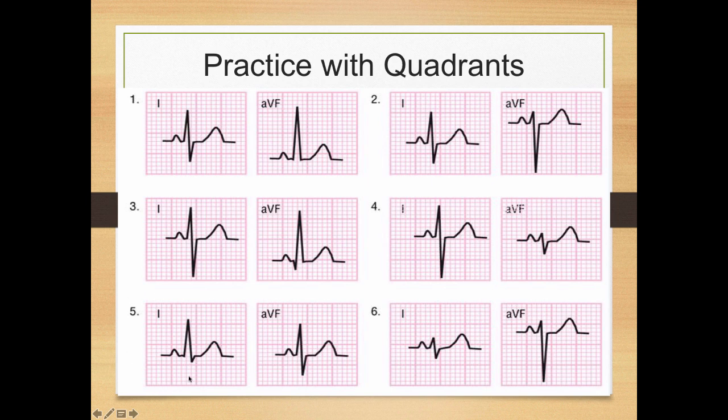Example number 5. Lead 1, I think we can agree that that is positive. There's a little bit of negativity there. It's a tiny, teeny tiny S wave, but mostly positive. We're going to call that positive. AVF, it's got some positivity and negativity to it.